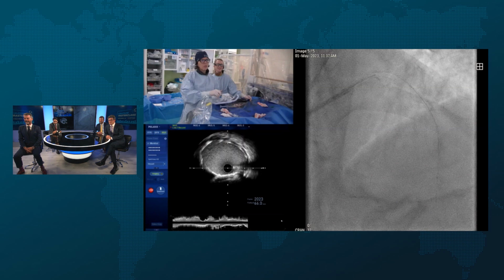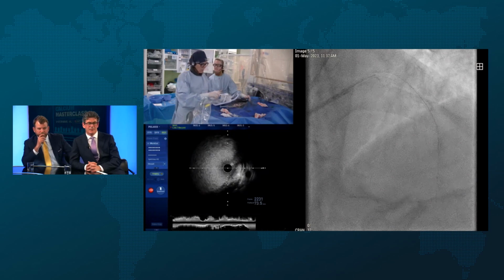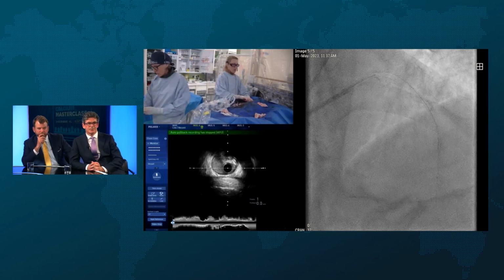As it's coming across the circ, that's nice. That's perfect. There's a lot to talk about. We can go back over this beautiful IVUS. Nice job, guys. But there's a lot to talk about. Brilliant. I'll go back. Really nice.